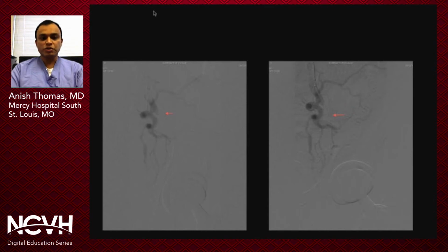Be careful in a situation like this, however, because if you damage or destroy the hypogastric artery during the procedure, that's your collateral flow to reconstituting the common femoral.